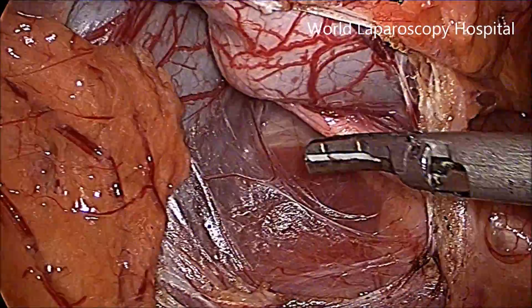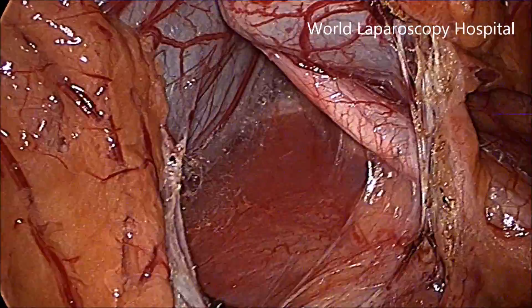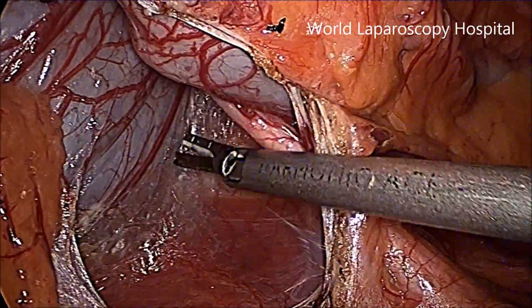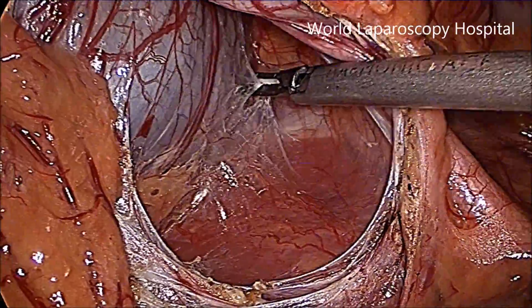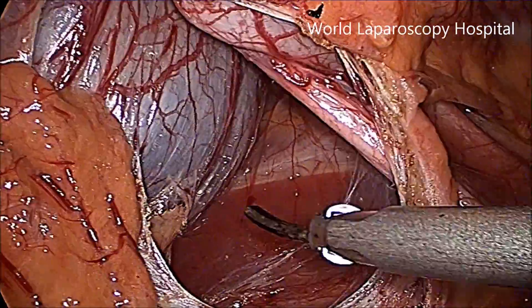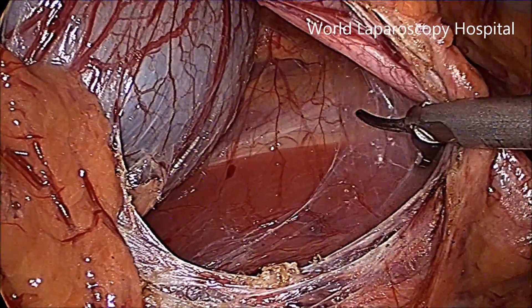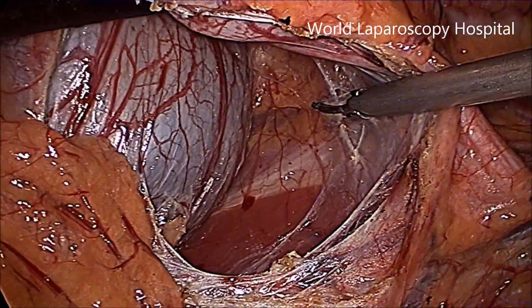Now here you can see the PUJ pelvis is visible together with the ureter. Just posteriorly here the psoas muscle is visible. The medial aspect of the psoas is an important landmark to recognize the pelvis and to recognize the ureter.